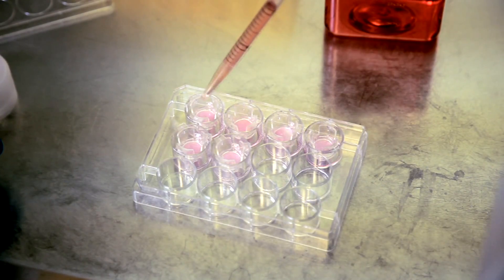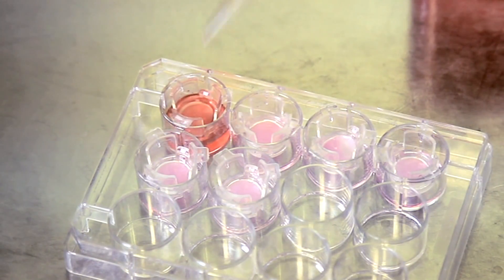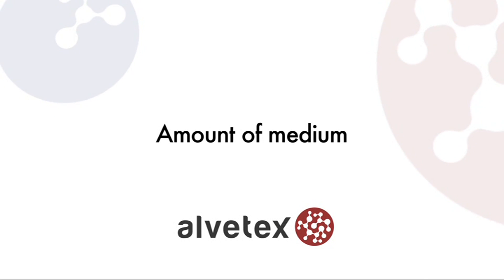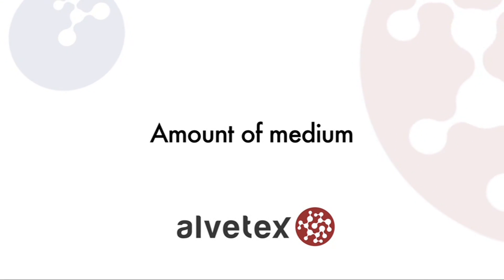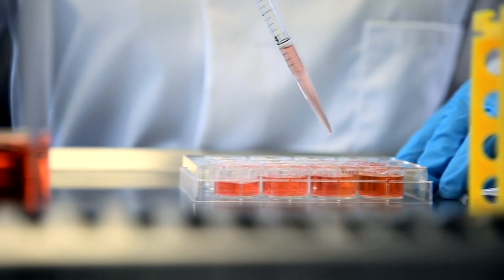After this, gently flood the wells with medium. The amount of medium to use depends on the Alvatex format you've chosen and the purpose of your experiment. If you're using a 12-well plate, you should use up to 4 milliliters of medium per well.